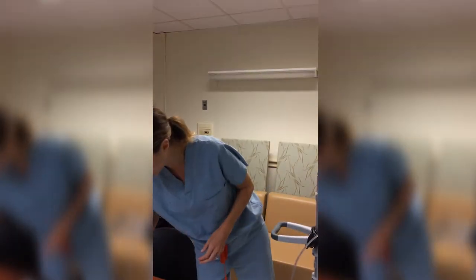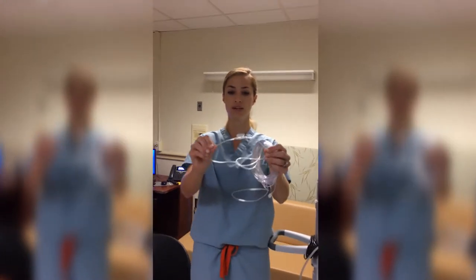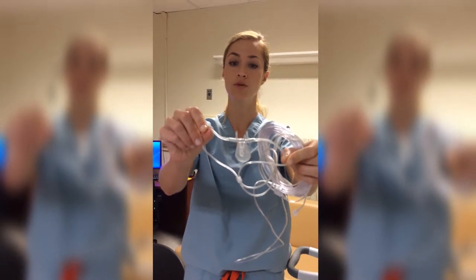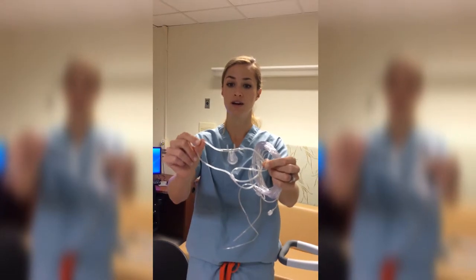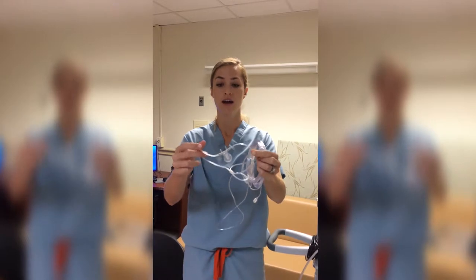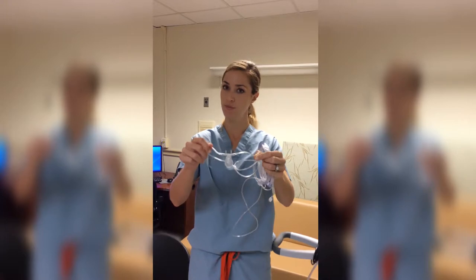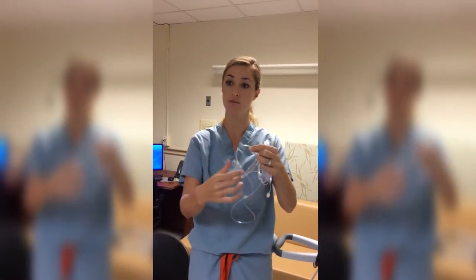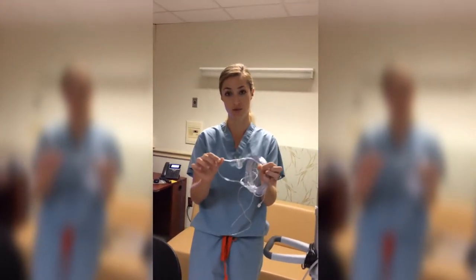The second option is the nasal-oral cannula. One nasal cannula delivers oxygen, the other collects end tidal, and it also has the spoonbill, which is the oral component. If you have a patient that's a big mouth breather, this is what you want to use — with nasal-nasal, you're not capturing all of the exhaled breath. That said, if someone is mildly sedated, the oral piece in front of their face might bother them and they may keep pulling it off. There's not a one-size-fits-all; use the one most appropriate for your patient.